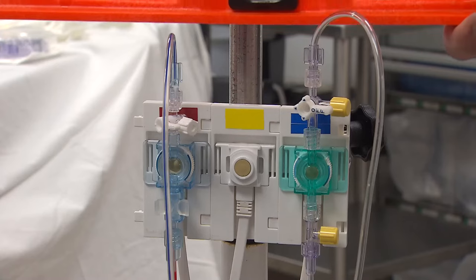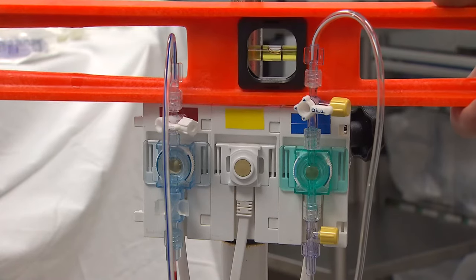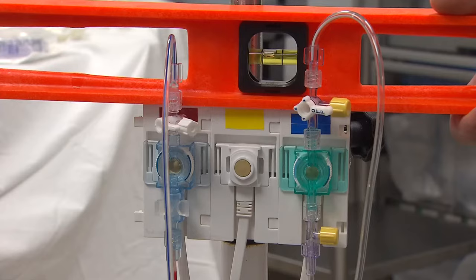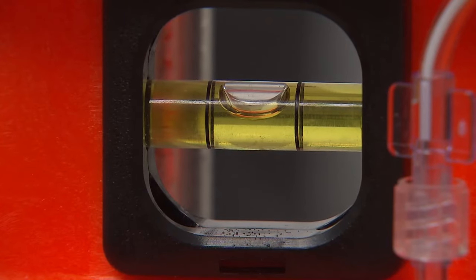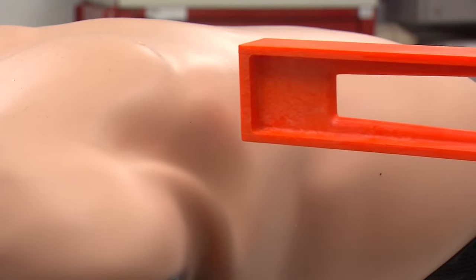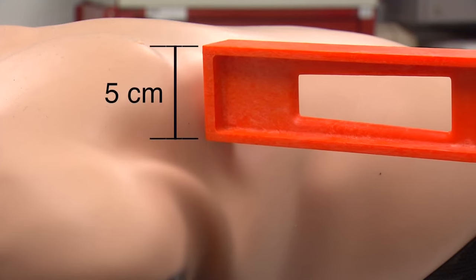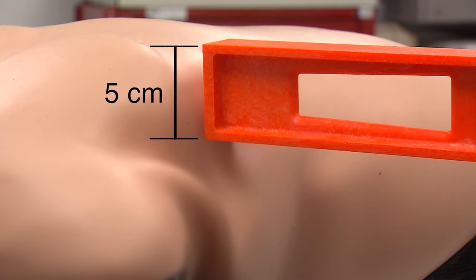The first step in setting up the PA catheter is to ensure that transducers are placed at the level of the right atrium. In a supine patient, the right atrium is approximately 5 cm below the sternal angle.